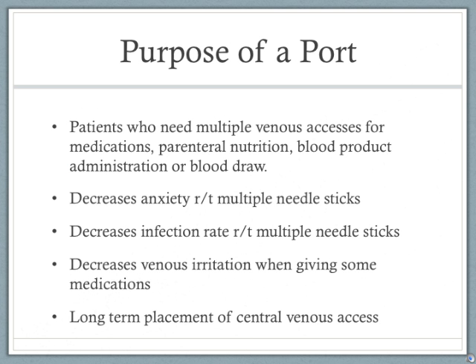The people we encounter who have a port are usually those who require multiple medical treatments or are sometimes pretty sick. They can have this for multiple venous accesses for medications, for parenteral nutrition for those who can't eat in the normal way, for blood product administration, or multiple and repeated blood draws.